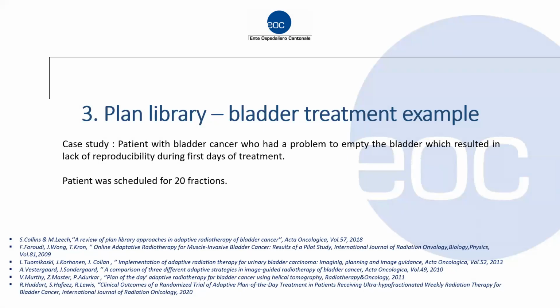Now, I would like to show you an interesting case of bladder treatment. This is a patient we treated with bladder cancer who had problems emptying the bladder, which resulted in a lack of reproducibility from the first day of treatment. The patient was scheduled for 20 fractions, so the treatment was not that short.